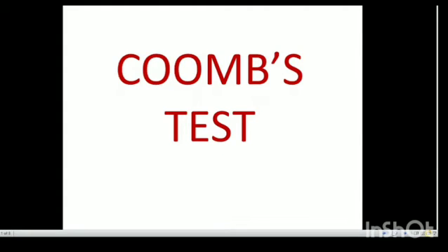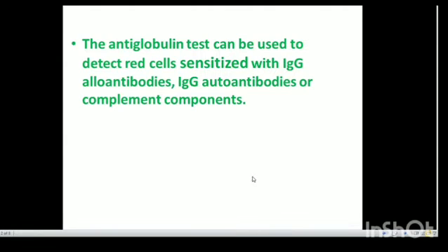In this video, we will discuss Coomb's test. Coomb's test can be done by three different methods. One is the tube method, second is the gel method, and third is by using flow cytometry. In this video, I will discuss how to do it with the tube method.